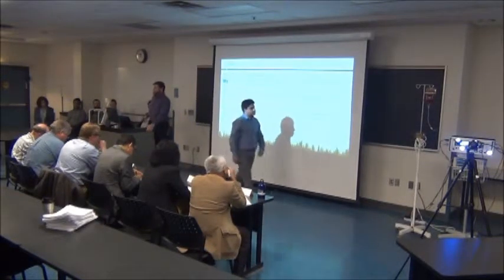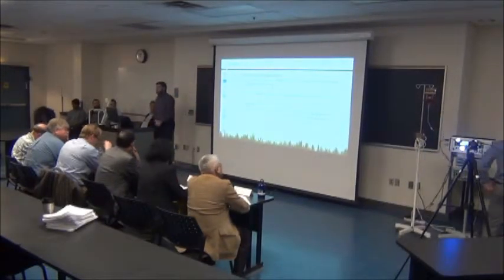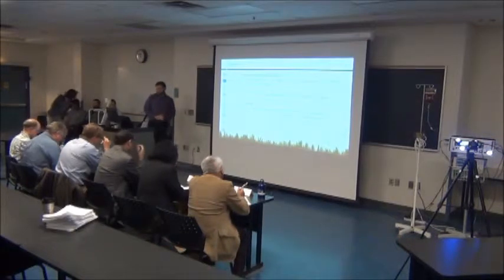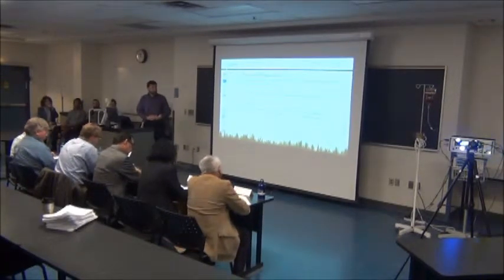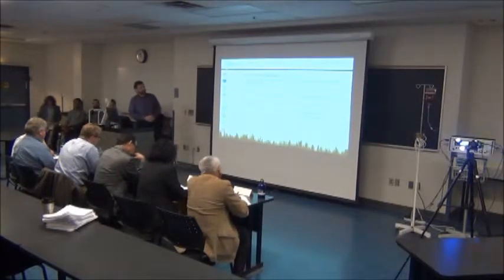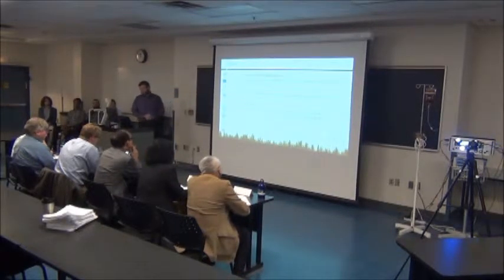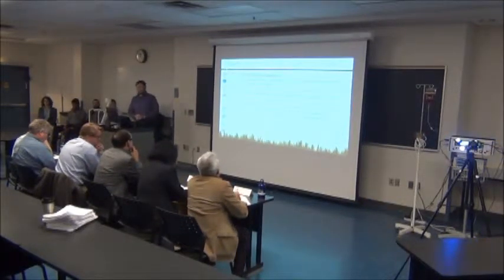So I'm going to go through some theoretical stuff first about the gain, bridging off what Geoffrey was talking about. From a biomedical perspective, gain produces an accurate amplified output voltage of the pressure transducer and also controls amplification of the output voltage. From a clinical perspective, gain increases the amplitude of the blood pressure waveform, which makes it better visual quality.